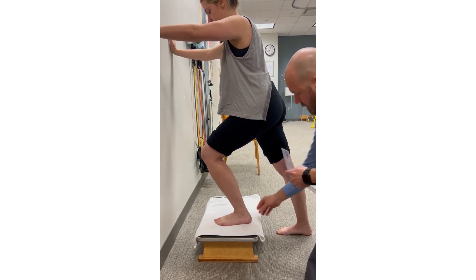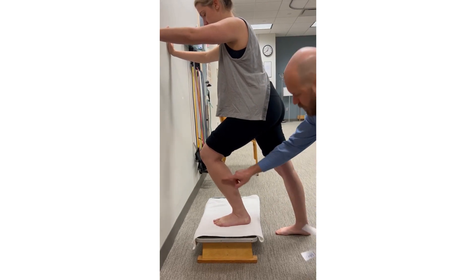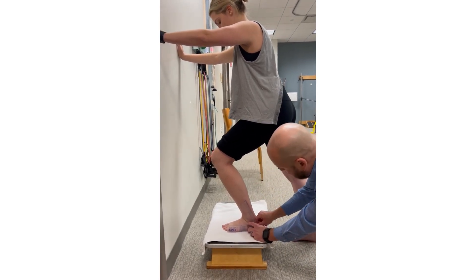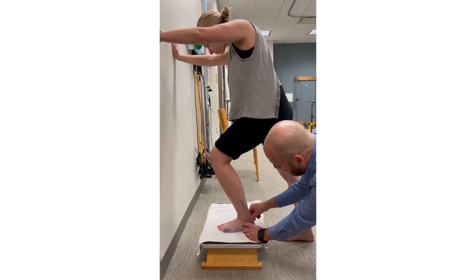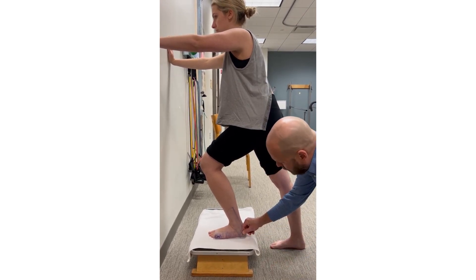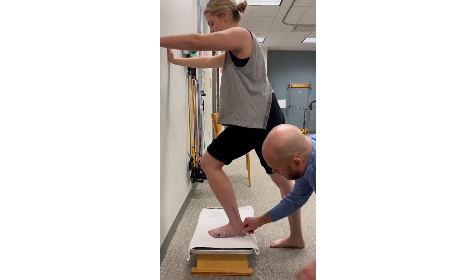We need to make sure that the calcaneus stays flat on the stool. The proximal arm is going to be lined up with the lateral midline of the leg, or the fibula. As long as her calcaneus stays flat on the platform, we can rest the edge of the goniometer on the platform, which will maintain parallel alignment with the fifth metatarsal for measurement.